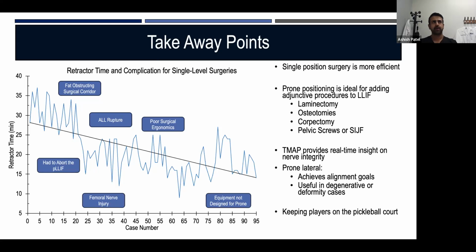Yeah, it's very versatile, right? You can go back and forth, and the next case that I was going to show really demonstrates that versatility. And personally, you have a revision type practice, and so do I, so that versatility is really nice. But yeah, your comment around placing the lateral plate: once you do have the implant in a good position, you do want to fix it there if you can.